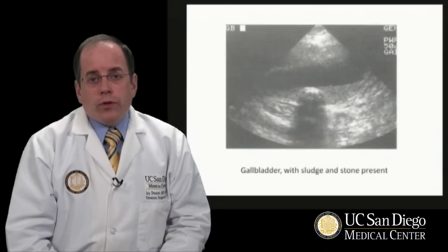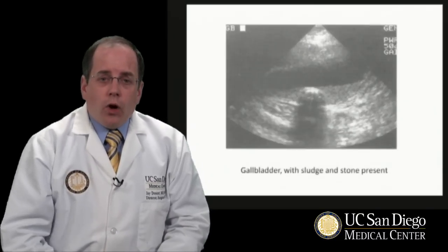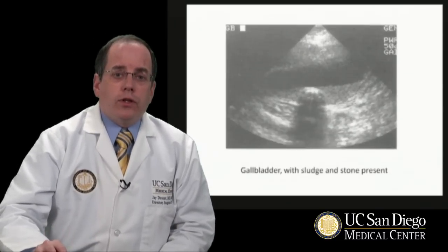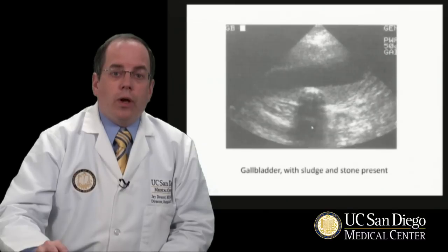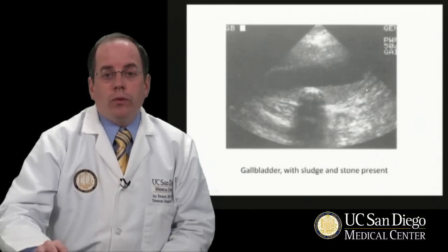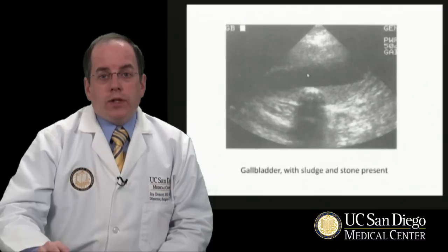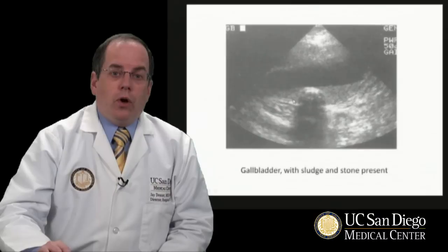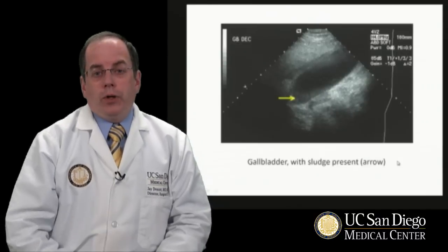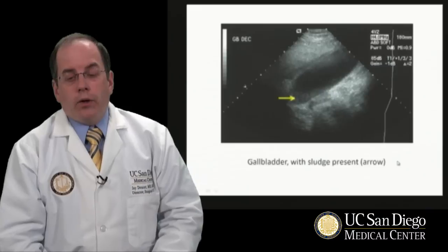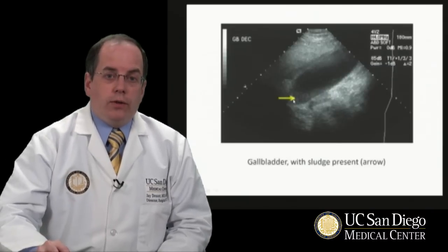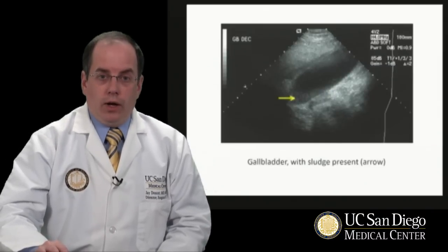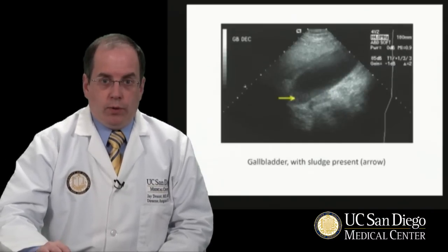Here's a patient who has both a stone and gallbladder sludge. The stone reflects sound quite brightly here with a lot of shadowing behind the actual stone. In addition, we can see dark bile here with some sludging dependent within the gallbladder. Here's another picture of a gallbladder with sludge present, and you can see the layering of sludge in the gallbladder. No stone is visible in this picture though.